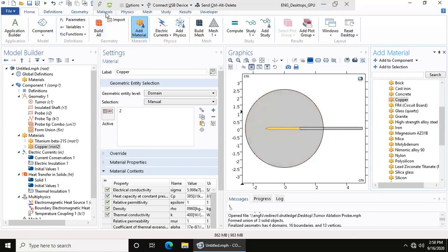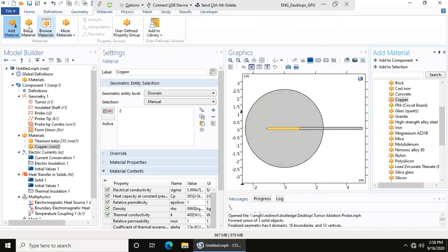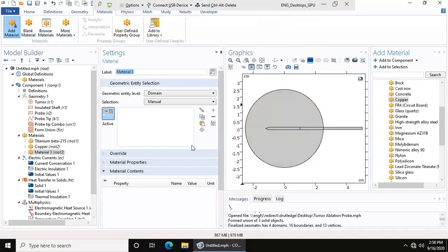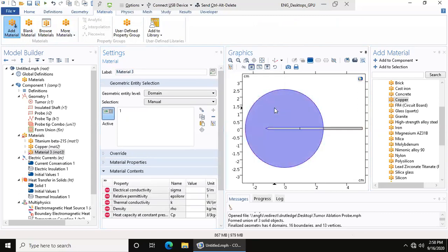What you're going to do is go up to materials, blank material, and you're going to choose the tumor.